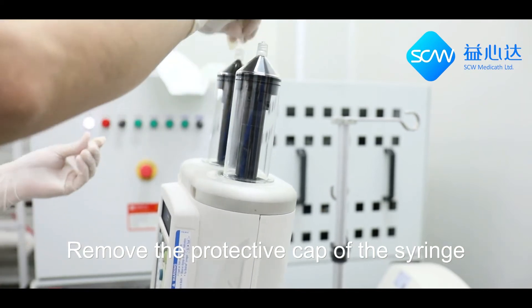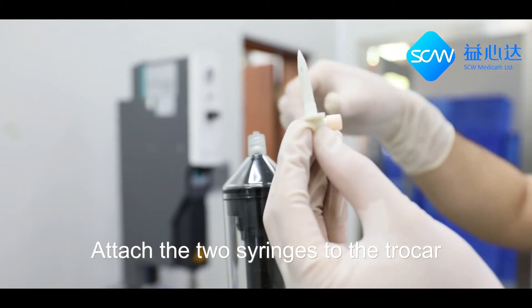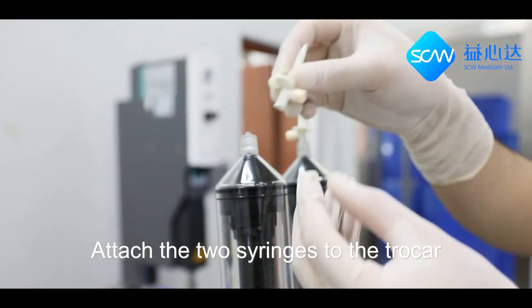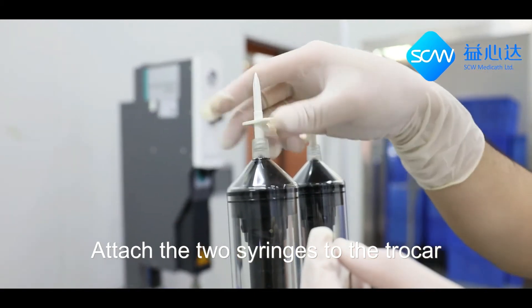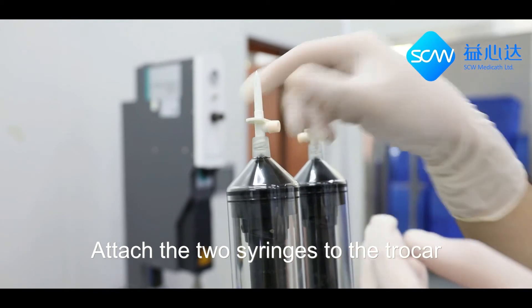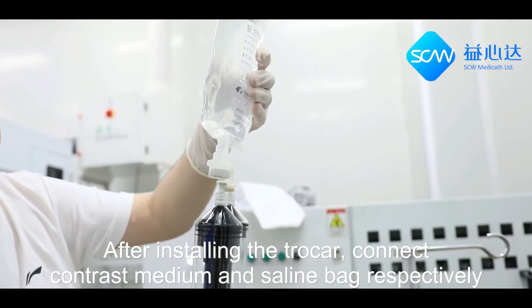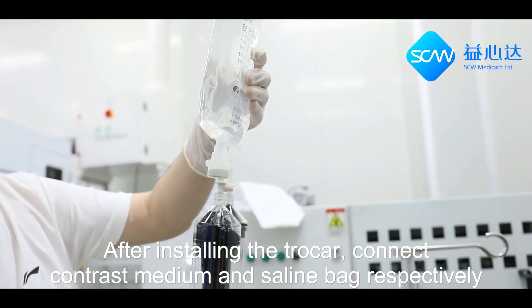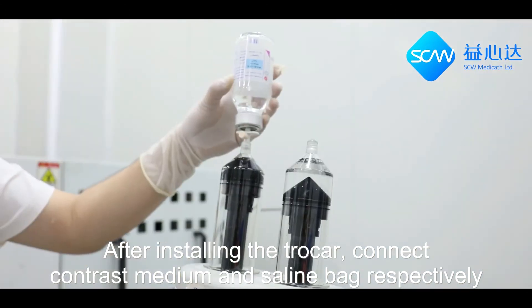Remove the protective cap of the syringe. Attach the two syringes to the trocar. After installing the trocar, connect the contrast medium and saline bag respectively.